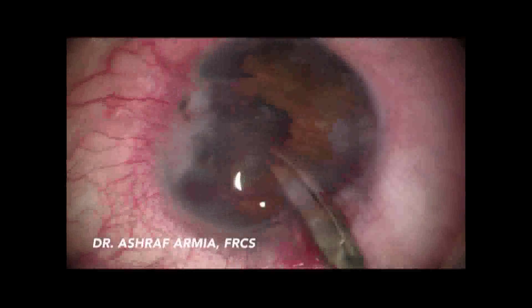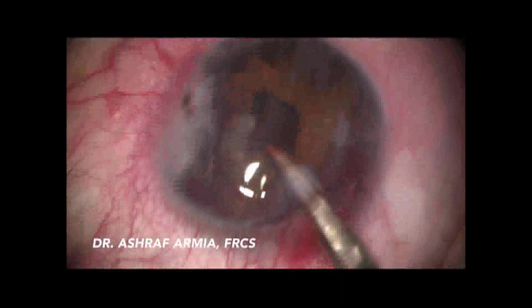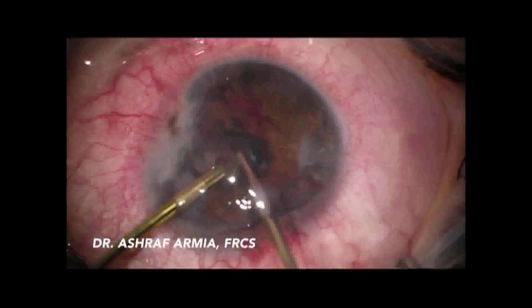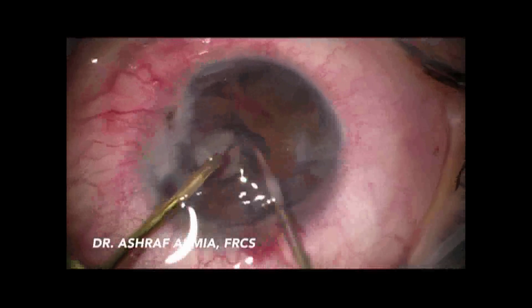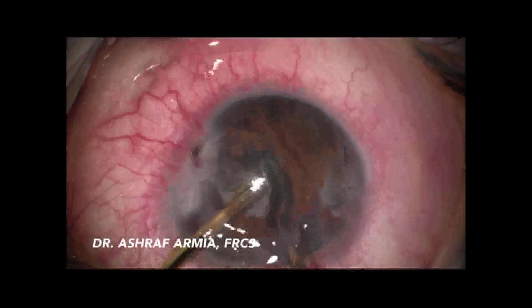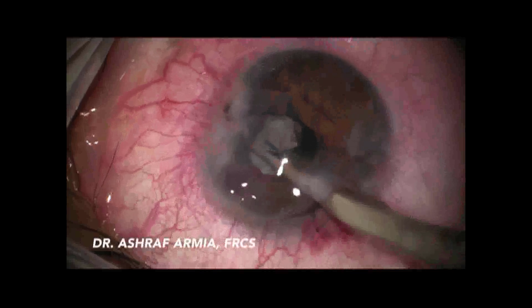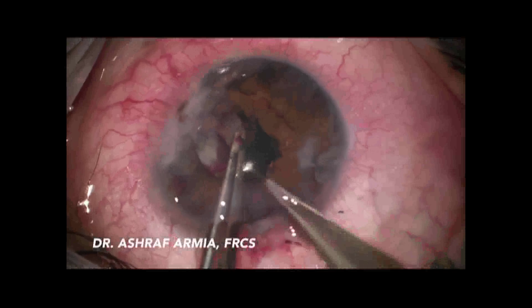Using a special anterior segment scissor, I started to cut the fibrous lens and the remaining adhesions. I then used the vitrector, trying to perform an anterior vitrectomy and cut the fibrous lens, but it was too hard to cut with the vitrector. So I shifted back to the scissor to cut the fibrous lens as much as possible using a bimanual technique.